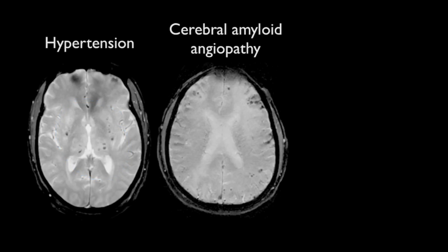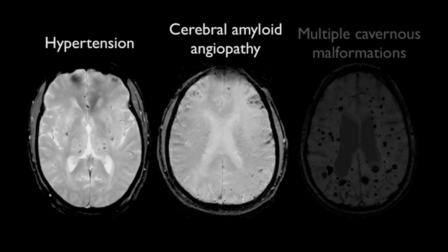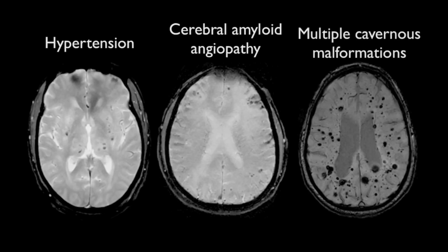A differential for these regions of signal loss is multiple cavernous malformations, seen either as an autosomal dominant condition or in patients who have received previous cranial irradiation.